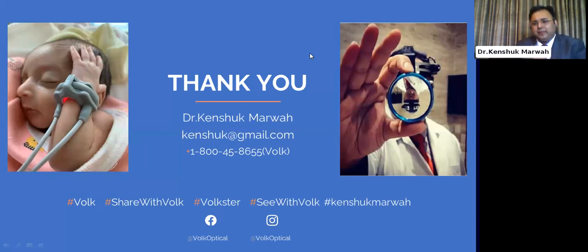If you want to look at the optic nerve or the macular edema, the first impression actually comes while you are looking at the patient clinically. The OCTs and the FFAs come later. So the first interaction with your patient is a clinical interaction, and when you are looking through a 78 diopter lens at that optic nerve, you will see a difference in the clinical practice.